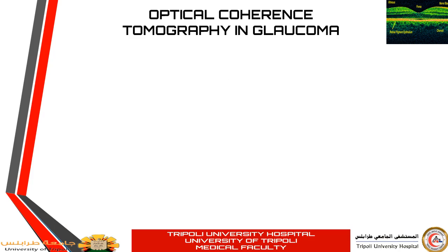Okay, the previous slides were a brief introduction to the terminology used in glaucoma and the different definitions and the different clinical ways of assessing a patient with glaucoma. Now we will go to the main subject of this lecture, that is the OCT. We'll give an introduction to the OCT, then we will go deeper and deeper till we end up with the interpretation of the map of the OCT.